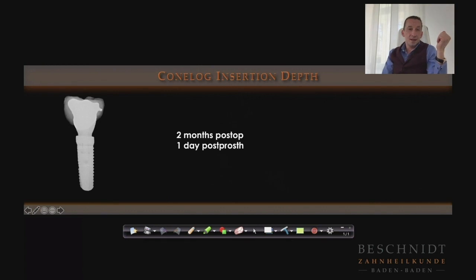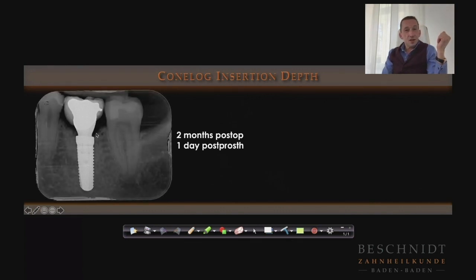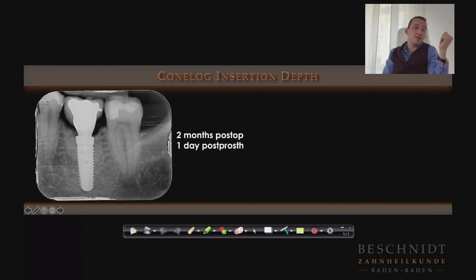So this is 2 months after surgery and 1 day after placing the crown. And you see the emergence profile is easily made with this height of emergence profile and distance between crown and implant shoulder.